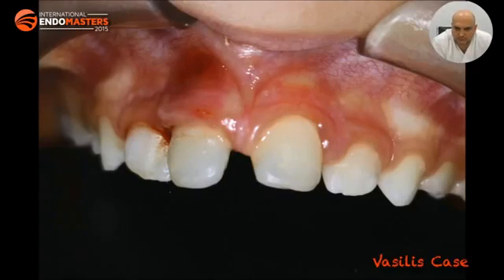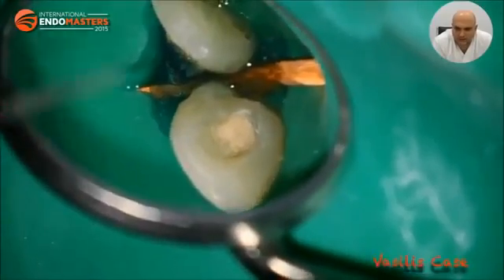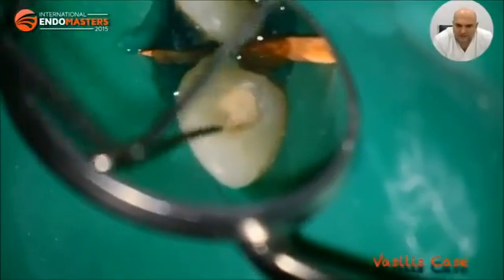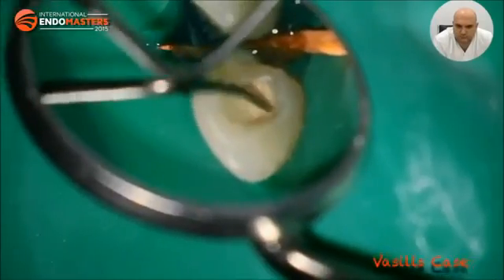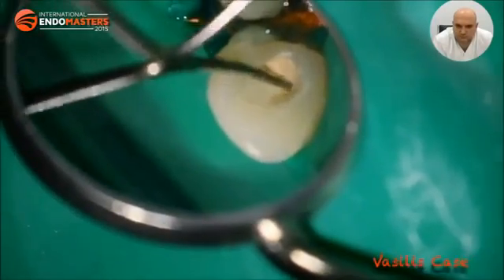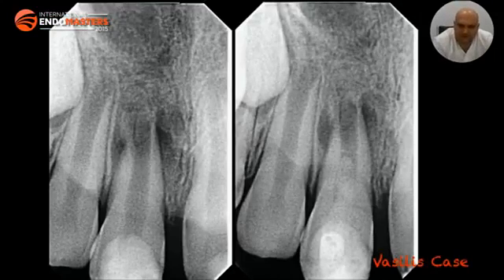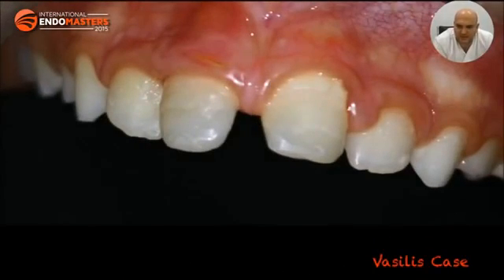asymptomatic, and the Biodentine was checked for proper settings. I'm tapping the Biodentine. Biodentine is set as a rock and I perform the final composite restoration. This is my postoperative radiograph of my efforts, and this is 7 months later.